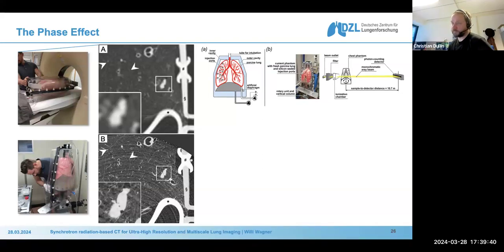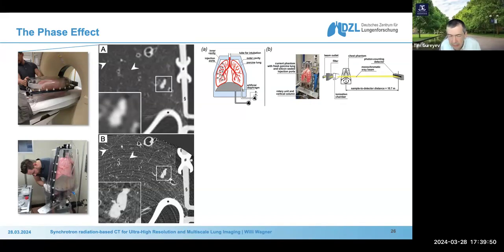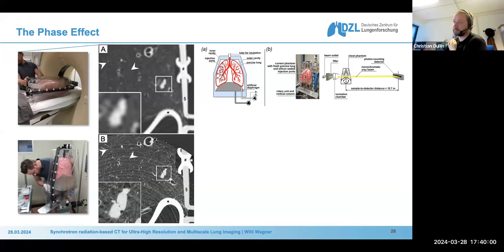We hope that the, let's say, the bulk material of the phantom simulates a tiny bit the soft tissue, but there is no rib cage. Yes. Right. So I imagine that affects the dose, right? When your lung is inside the body, the dose will be higher, presumably, in order to provide the same image quality, correct? Presumably correct.